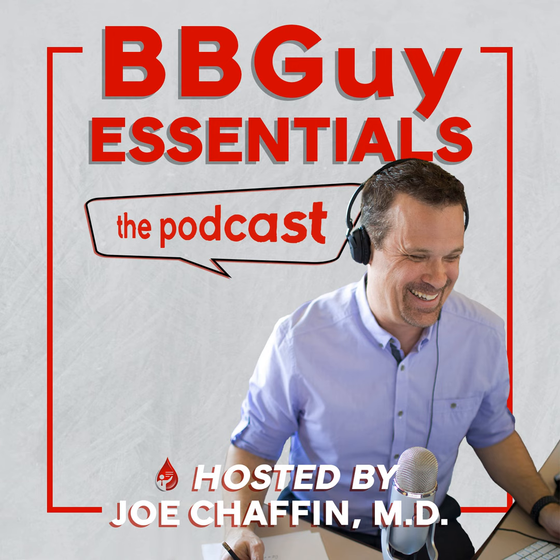We have a policy here, and again, Europe's slightly different to America in terms of how much we phenotype, but when we have some of these patients, we just do an automated Rh phenotype and K phenotype and give out blood on that. I don't know if that happens much more in the US. I know people are phenotyping and genotyping their blood so much better, so there's so much more on the shelf. So there was actually a BEST collaborative study that was done on this not too long ago, and I'll put that reference in the show notes.